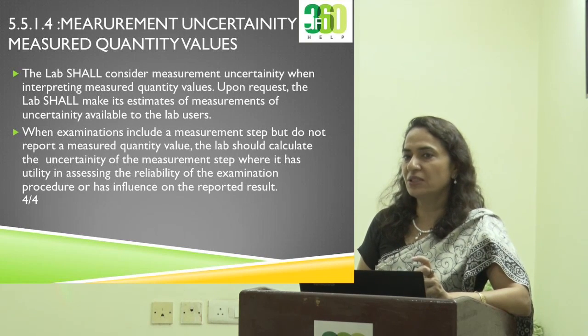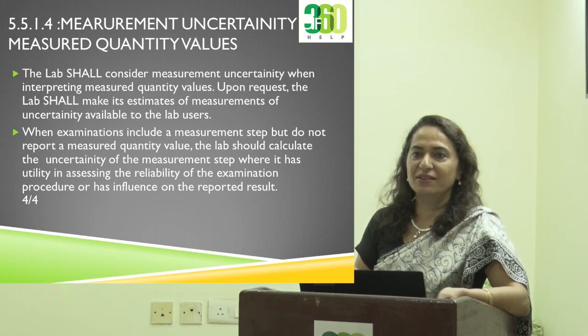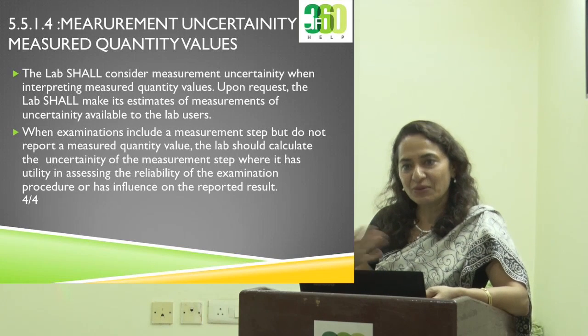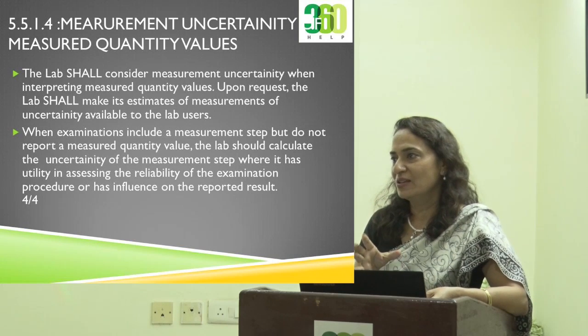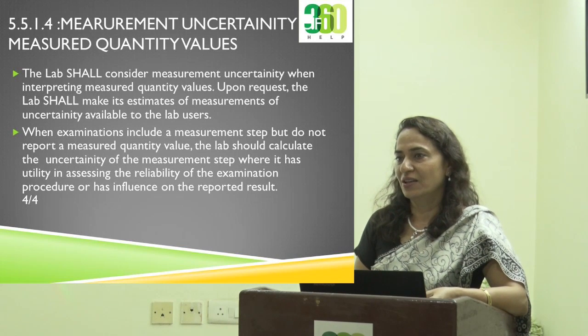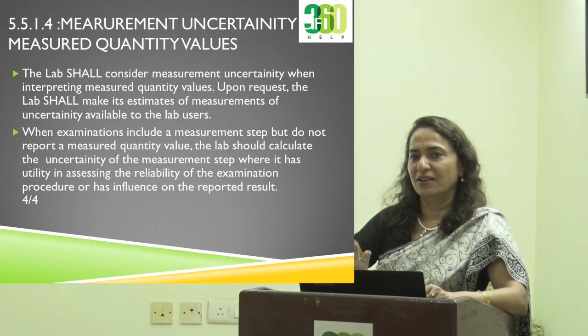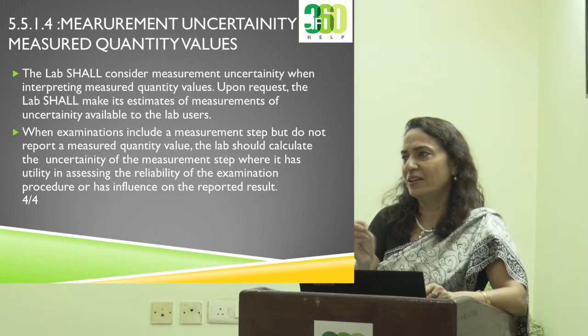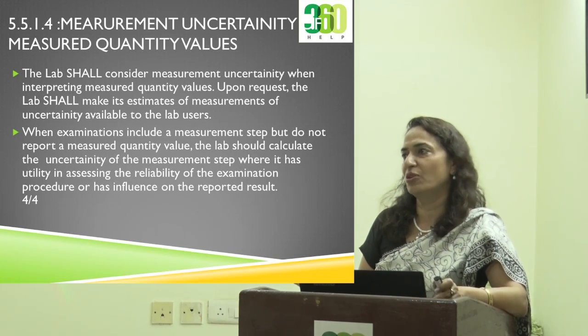But your clinician should also understand what CV percentage is. So far in our kinds of setups, we ourselves as the lab people also don't understand it that much. So what to talk of physicians. So to the physician we normally say okay, 5-10 difference, it's okay. In creatinine, okay, 0.2-0.3 here and there, don't bother. Actually it should be the exact CV percentage of the lab within which he should not bother.